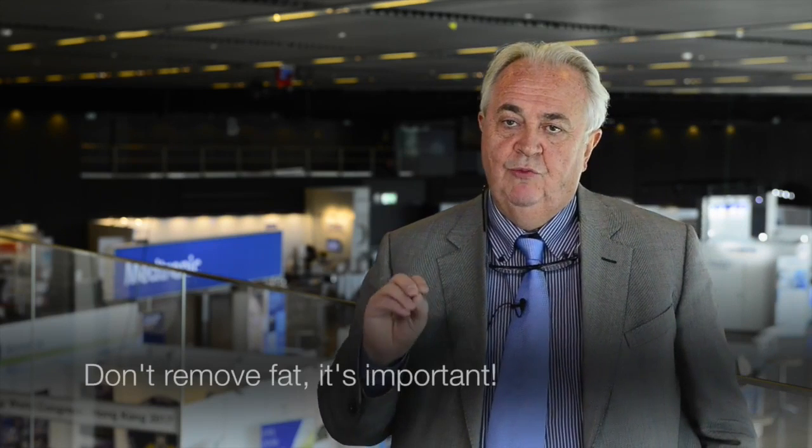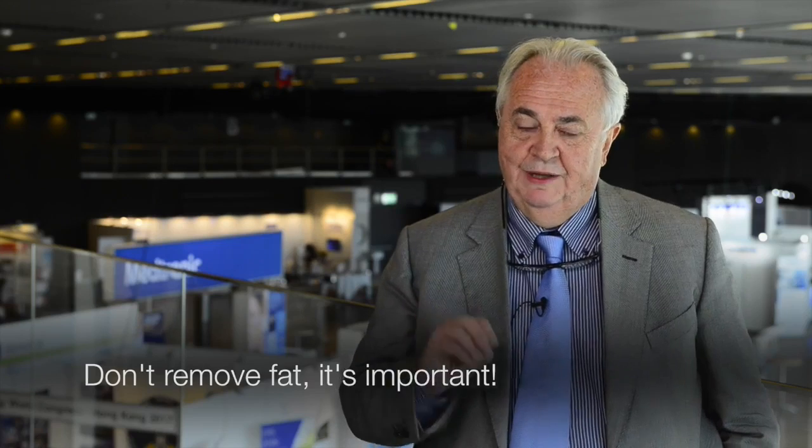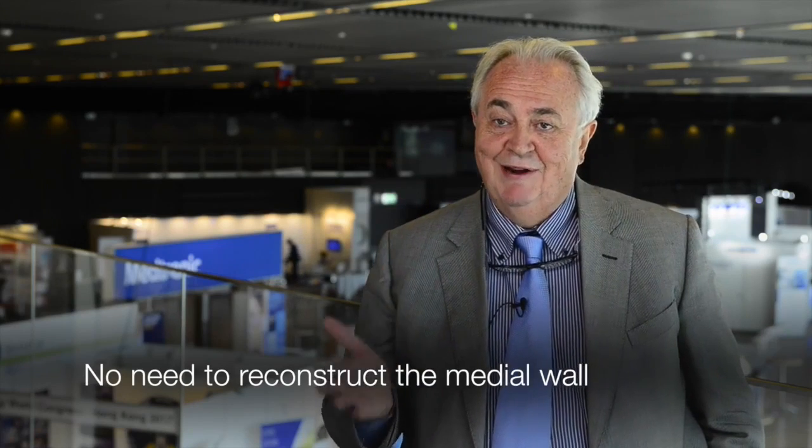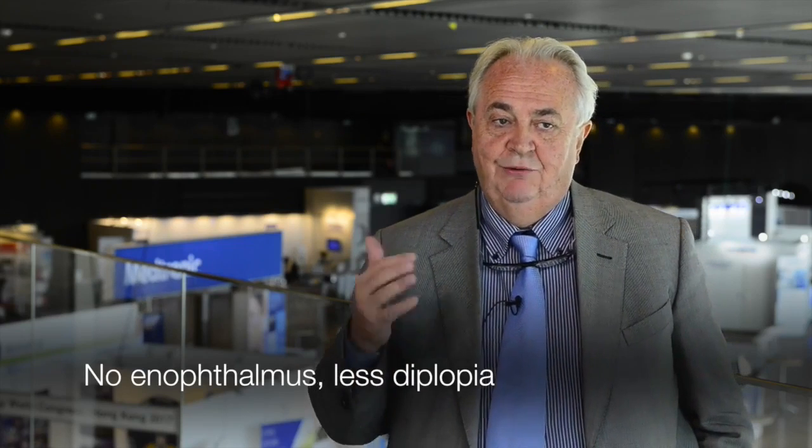In this surgery, the amazing thing is that we always try not to remove the fat. The fat is really important for the orbit. If we preserve the fat, we don't need to make a medial wall orbital reconstruction, and we avoid enophthalmos, and we have a much lower rate of diplopia post-op.